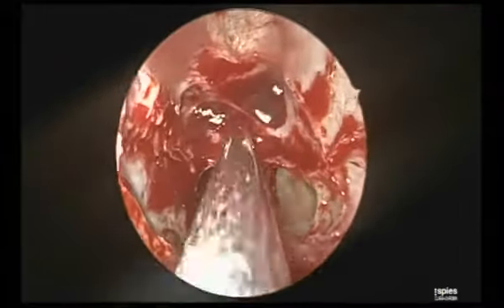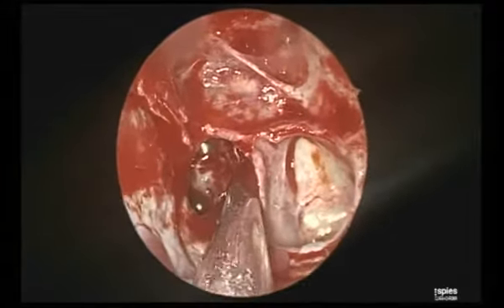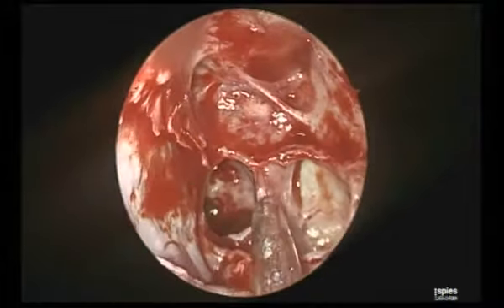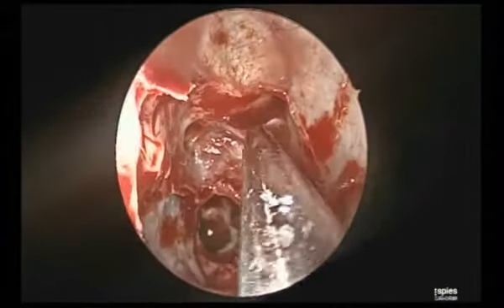I tell you, never ever be fearful about the onodi if you stay anterior to the ostium. Just shatter your fear 100% if you stay anterior to the ostium. Simply, you can't damage anything. Even if there is onodi or anything, it's going to be behind the level of the ostium.